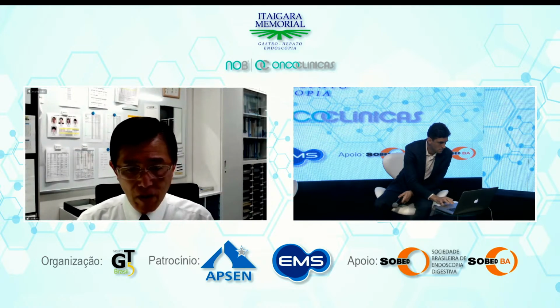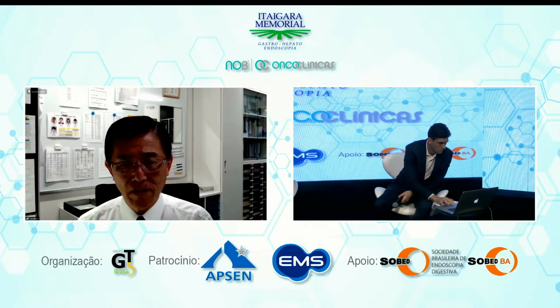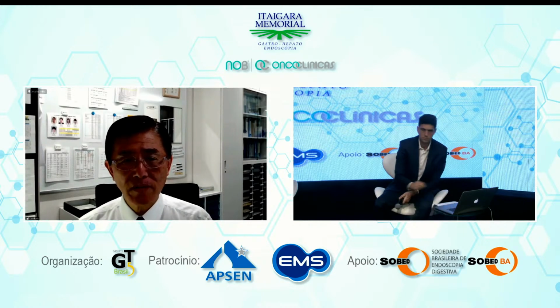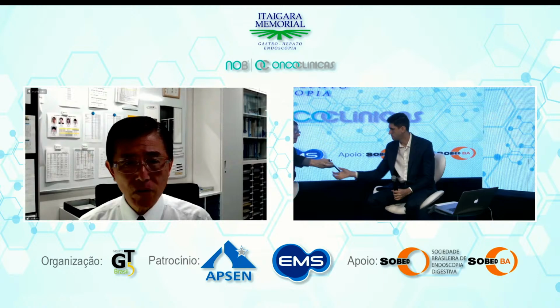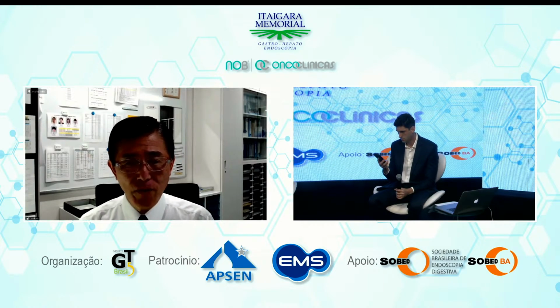It also helps to determine the therapeutic strategy. If a lesion is carcinoma, we should do EMR, not polypectomy. If carcinoma, we have to resect en bloc, so EMR or ESD. But benign adenoma can be treated by piecemeal EMR. Like this, magnification is becoming essential.